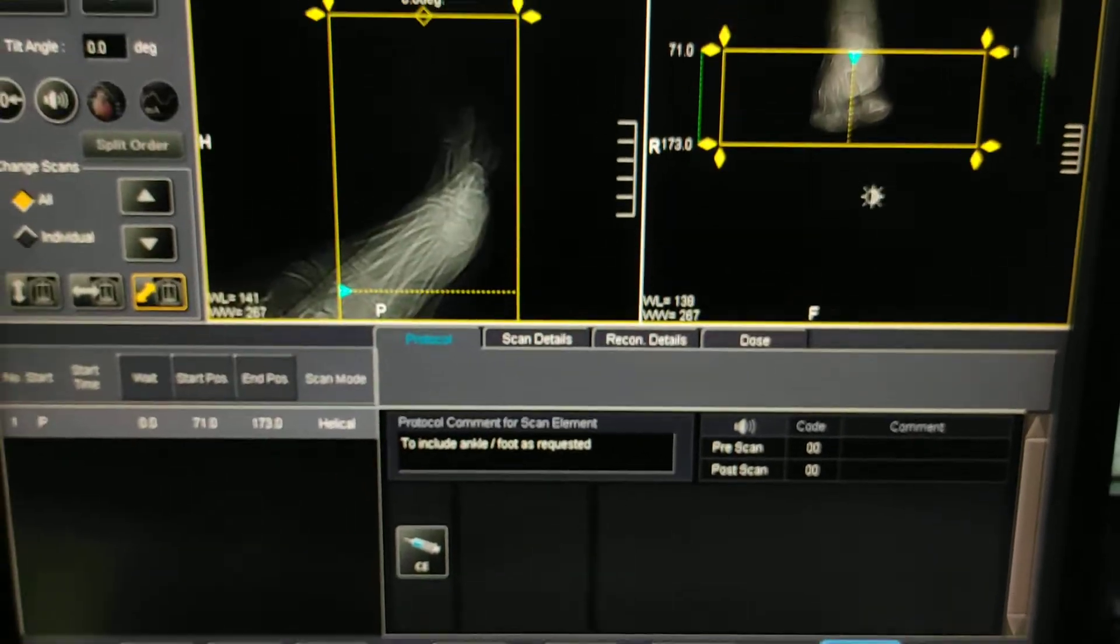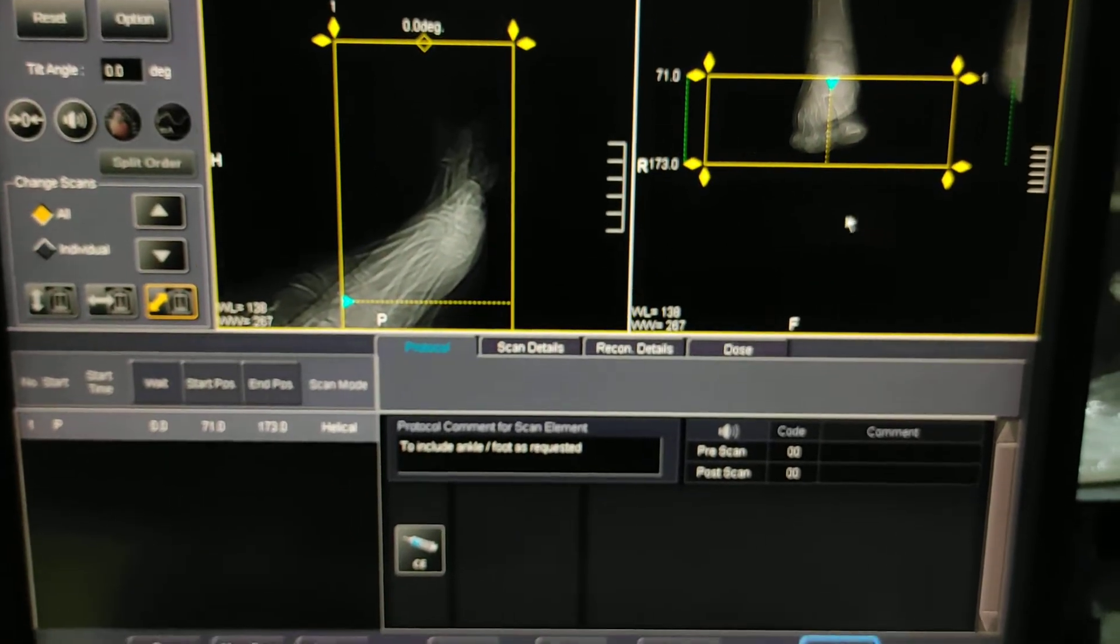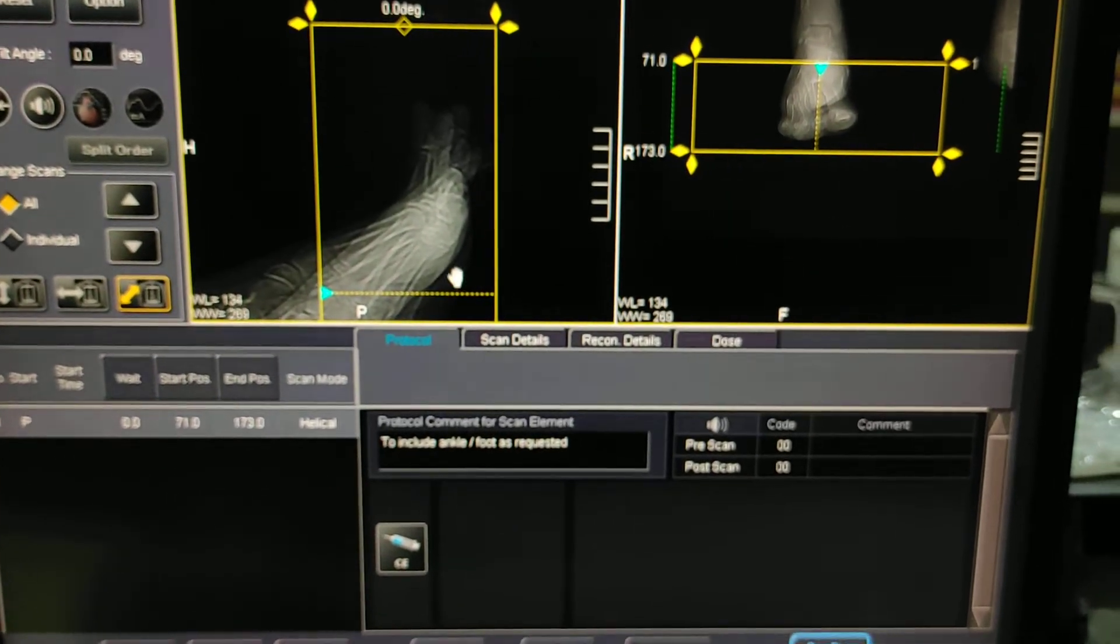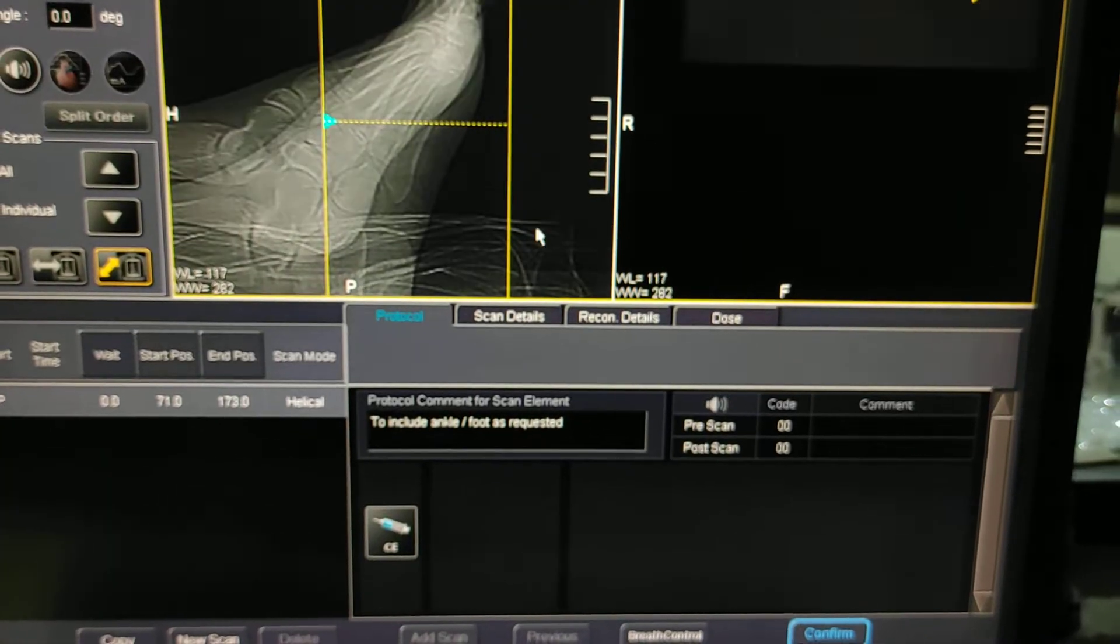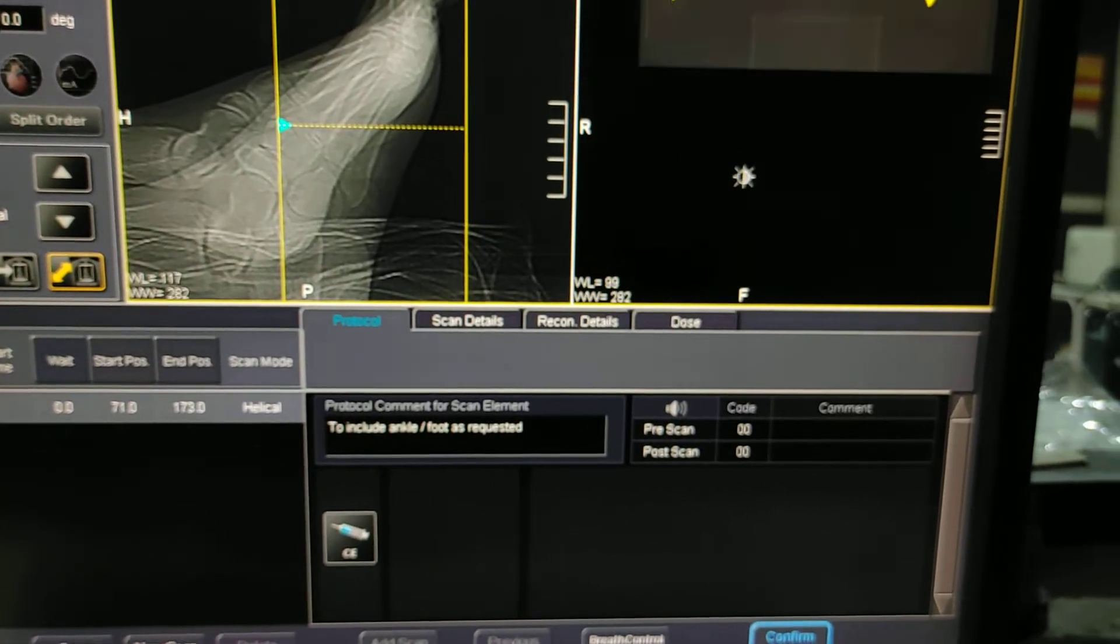So this is how you can do CT scan of foot on Toshiba 16-slice.